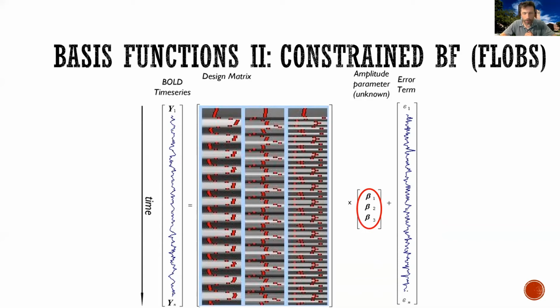It would be pretty hard to tell what it means if condition A and condition B across your group of participants were different in this regressor right here, or in this regressor right here. And on top of it, as I said, it's then difficult to aggregate these at the group level. How to evaluate in a group level fashion is not obvious.